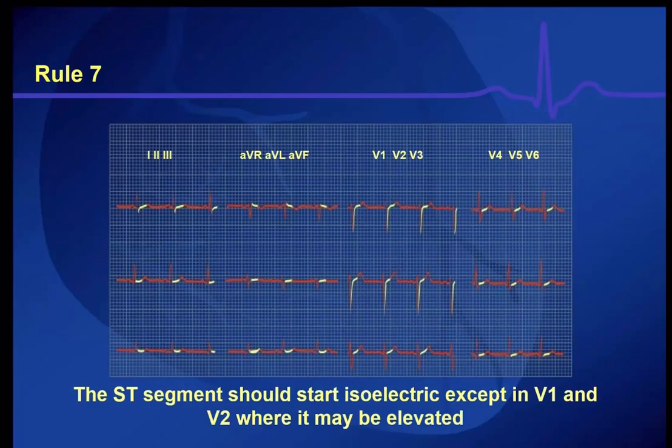Sometimes if you are in doubt, you might still need to go to the cath lab to make a clear demarcation between whether it is a real ST segment elevation or not. Other causes of ST elevation include acute pericarditis, high J point, or LVH. But the most important thing: if you see an ST elevation, think about myocardial infarction as your first and important differential diagnosis.